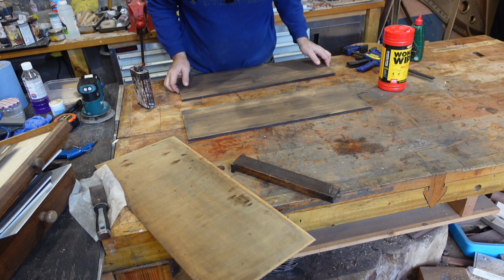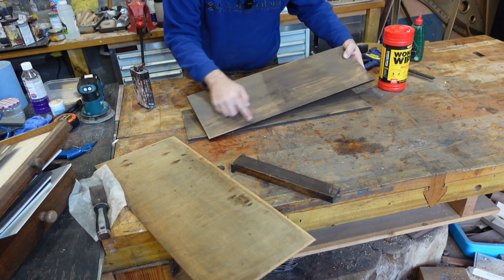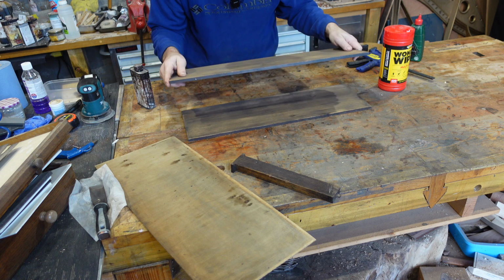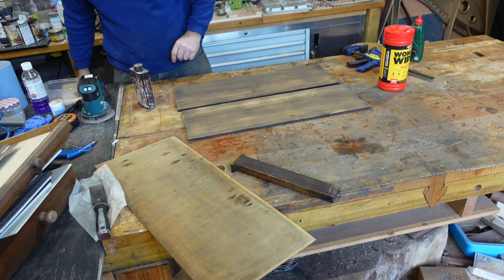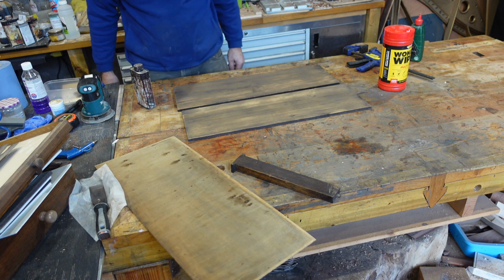So I've given them a light sanding. You can actually see some band marks on them from where it was cut, probably with a bandsaw. I don't know if these were original. They're certainly a different wood from the rest, so they might have been added later. But I'm just going to stain them back and get them nice so that they don't look as marked anymore on the inside.